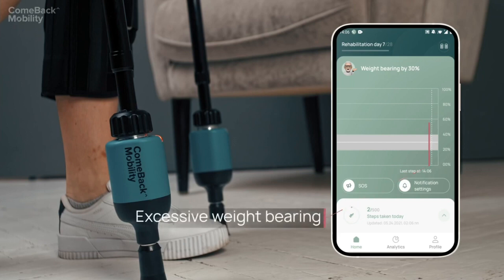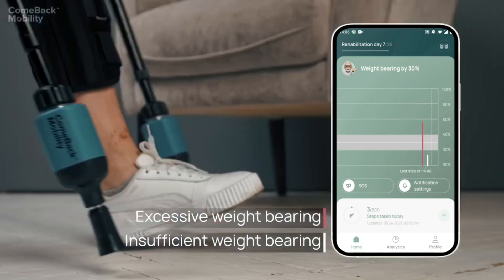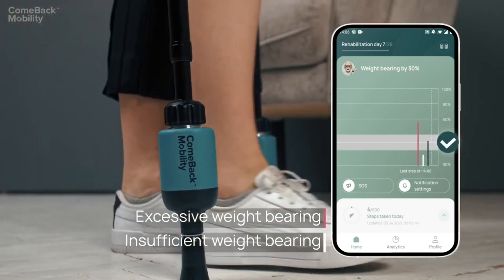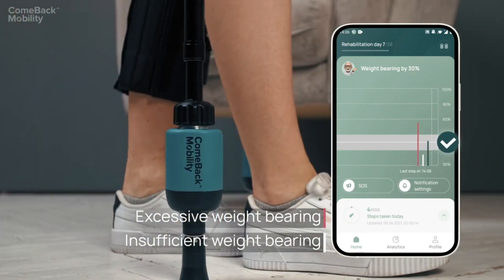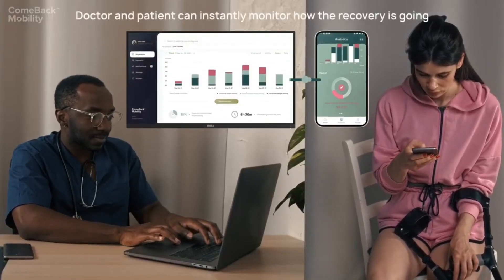The tips provide real-time feedback: "Step softer" or "Step harder" as needed. There is no feedback when the patient is walking correctly. Data for each step is shown in the doctor dashboard and patient app.